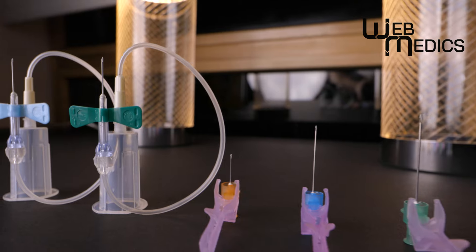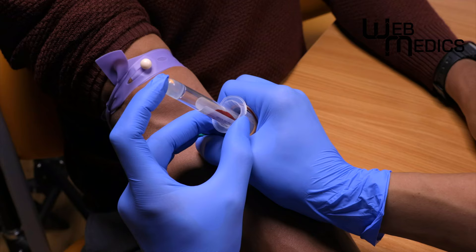Would you like to see venipuncture techniques to find veins easily and draw blood in one go? The process I would like to share with you - position, angle, maneuver - is a system I created to organize my thinking in the same way we organize our equipment.